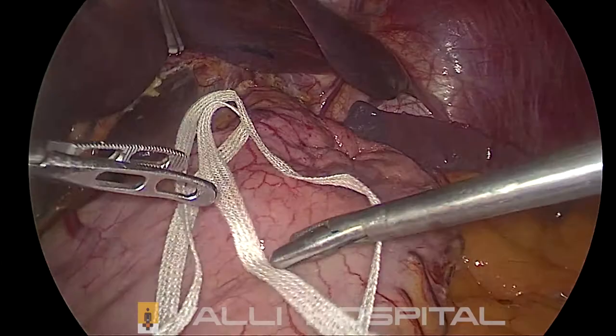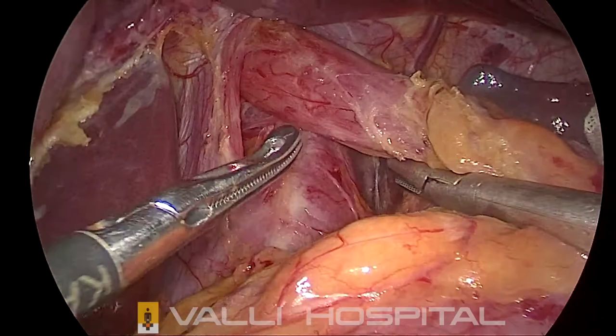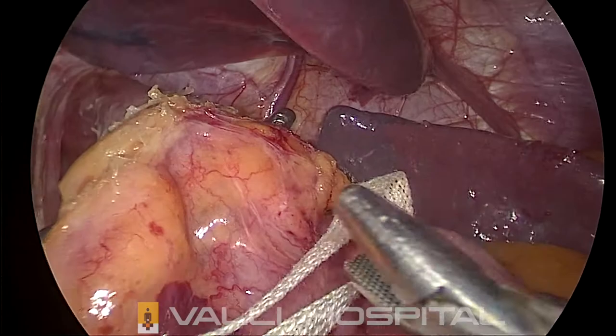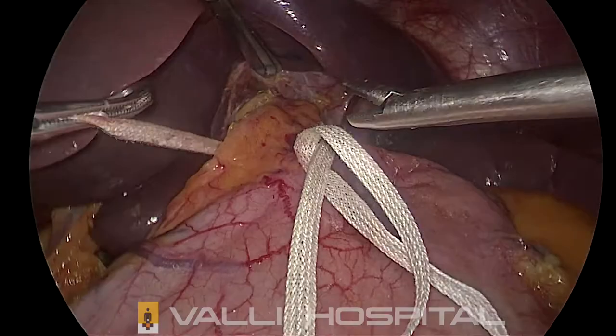This is a cotton tape. I want to tie it at the OG junction. Take a curved bowel grasper with the tip pointing upwards. The curved grasper is better. It is easy to catch if the tip is pointing upwards. With a straight grasper, it is a little bit difficult to feed it. So it is better if you use a curved instrument. A blunt curved instrument is better.